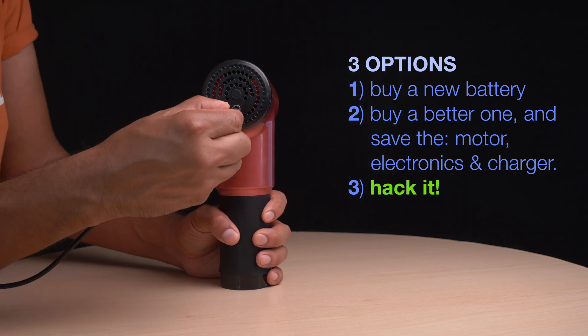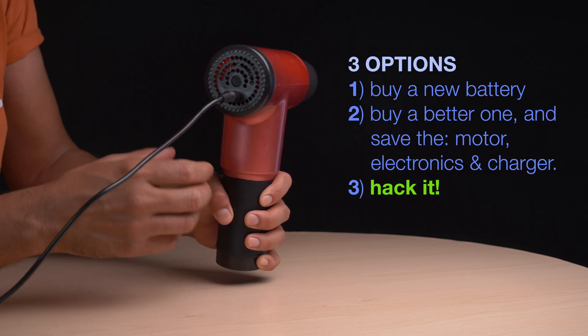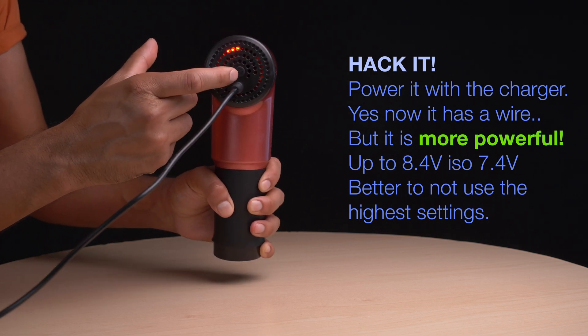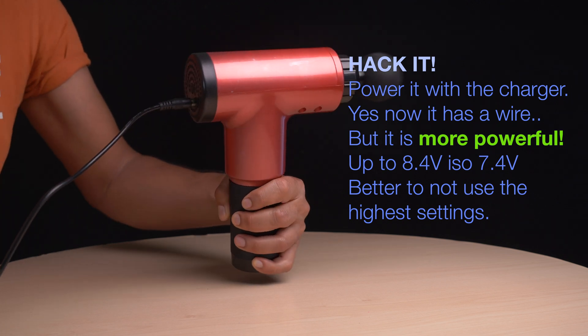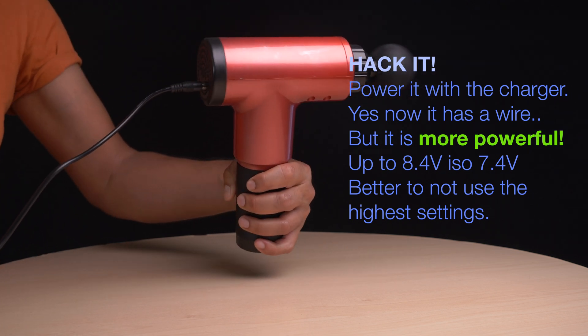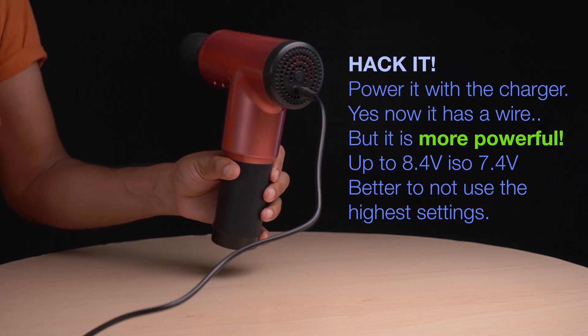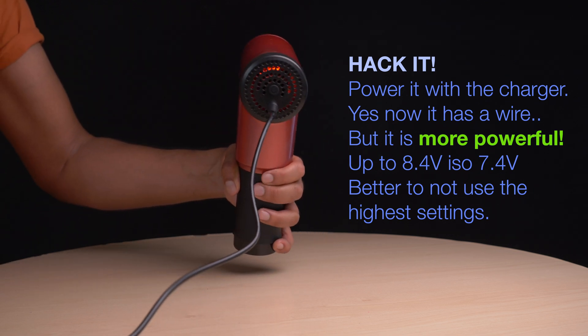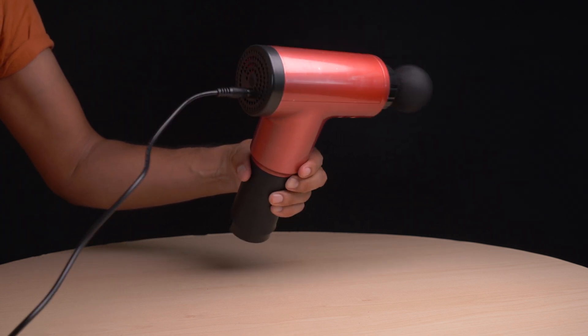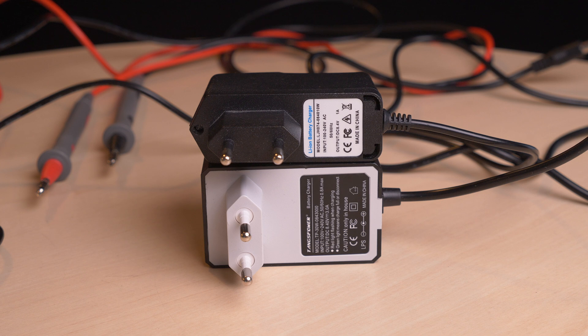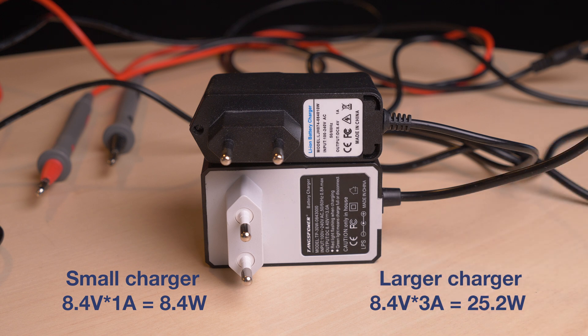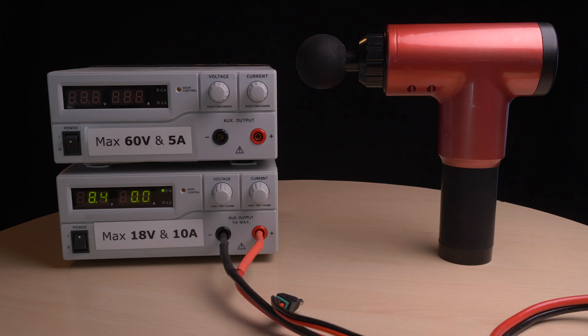This massage gun works when you power it with the charger. That's not the way to do it, but it works. Normally, the massage gun gets 7.4 volts. From the charger, it gets 8.4. That's a bit much, so I would suggest to not use the highest settings. Be sure to calculate how much power your charger can deliver. It needs to be more powerful than the massage gun needs. Otherwise, you can get fire.